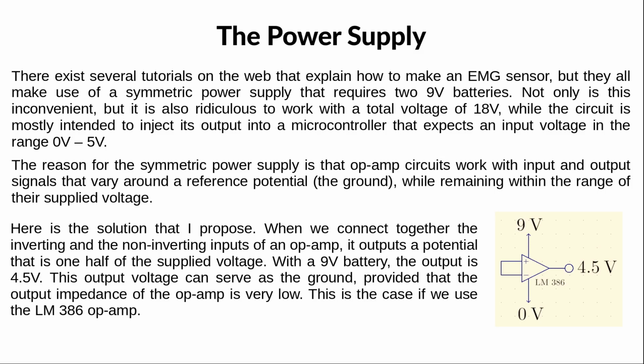The reason for the symmetric power supply is that OpAmps have their input and output voltages that vary around a reference potential that must be within the range of their supplied voltage. We cannot use a simple voltage divider in order to generate a reference potential because the reference voltage must have a low impedance. The solution that I propose is very simple.